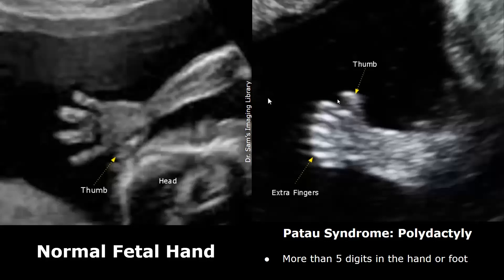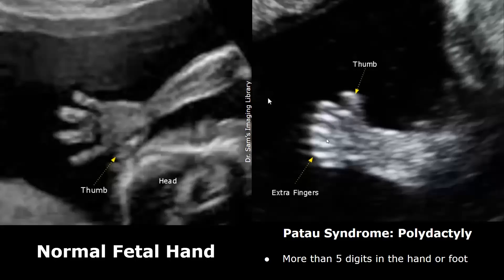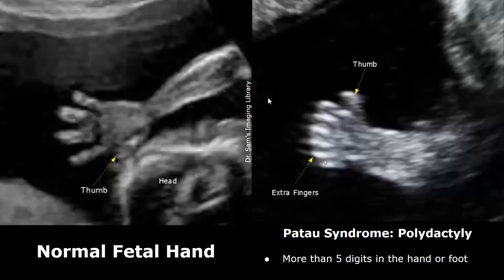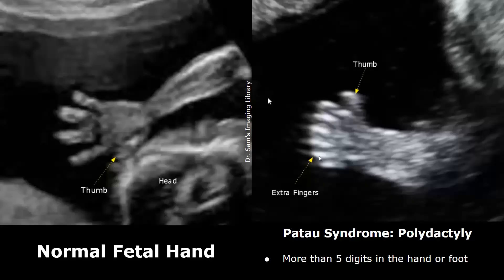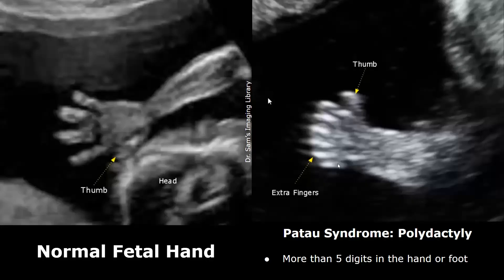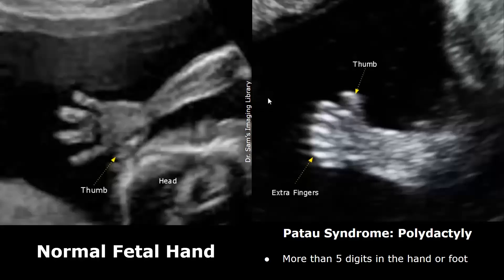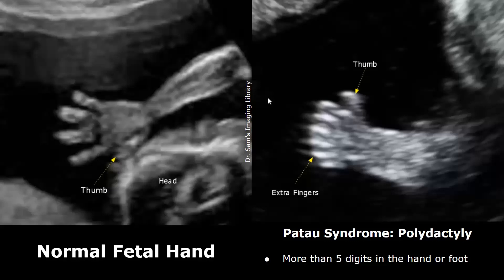Polydactyly means having more than five digits in the hand or foot. In this image, we see one thumb and six fingers — these are the extra fingers. This indicates polydactyly. So if polydactyly is present along with holoprosencephaly and facial malformations, then these features strongly suggest Patau syndrome. Ultimately, Patau syndrome is confirmed through amniocentesis or chorionic villus sampling.